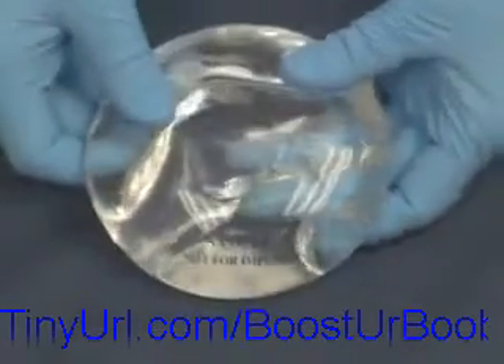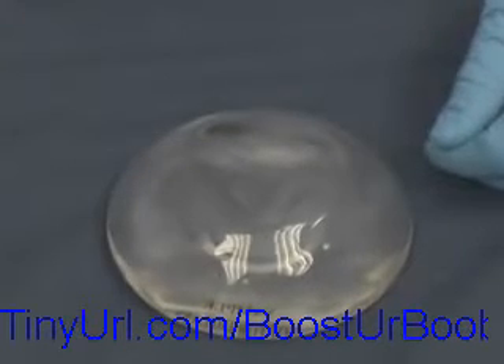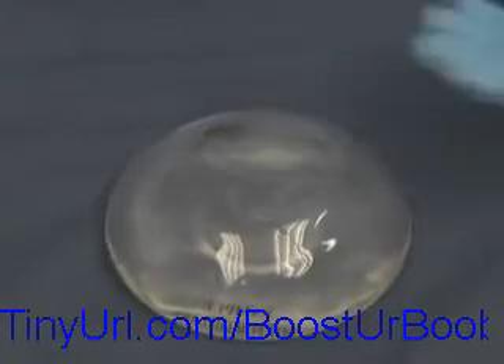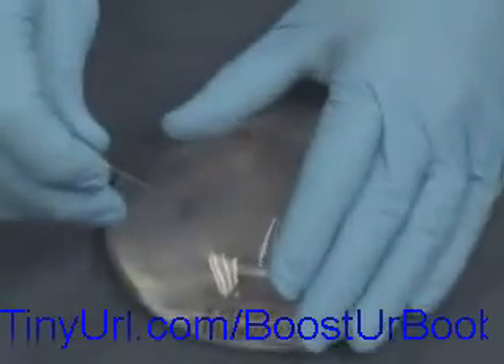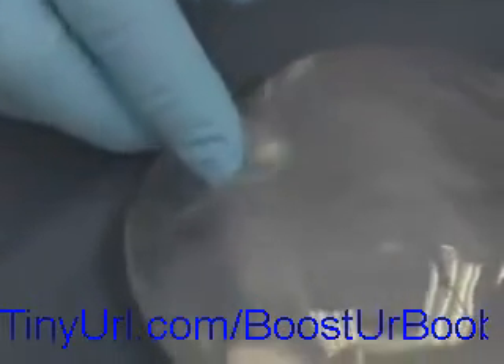This one is manufactured by the McGhan Corporation and is called the Natural implant. We're going to start by injecting a needle into the implant to see if we can get any of the material to come out. What you'll find is that if any material does come out, it goes right back in. Using a large needle and injecting right there — if you compress it, it's very difficult to get any material to come out because it's a thicker material. You might see a little bit of silicone emerge, but when you relax the pressure it goes right back in.